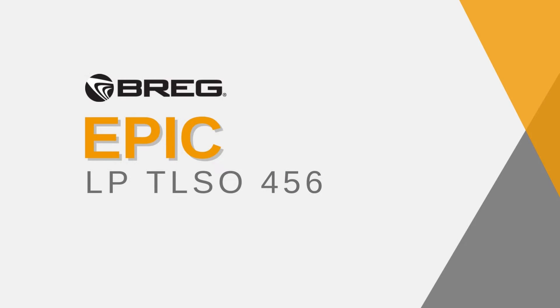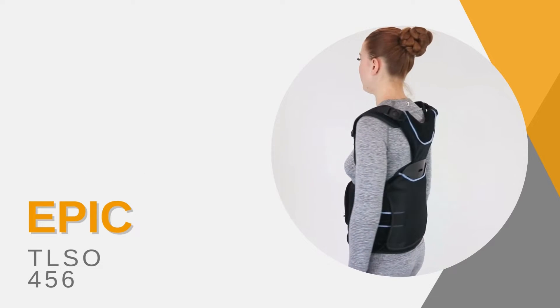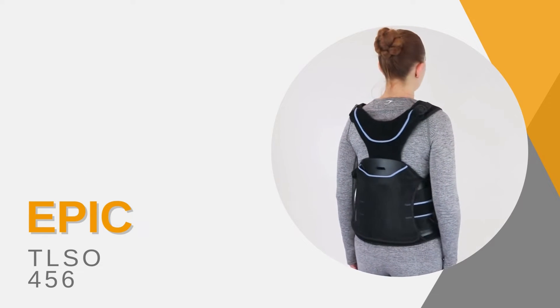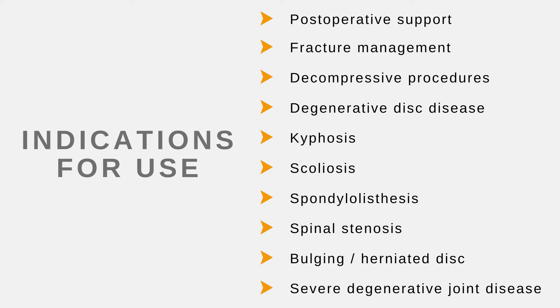Bregg EPIC TLSO 456. Indications for use: postoperative support, fracture management, decompressive procedures, degenerative disc disease, spinal stenosis, bulging herniated disc, spondylolisthesis, severe degenerative joint disease.